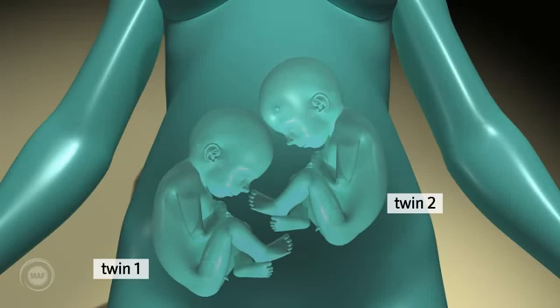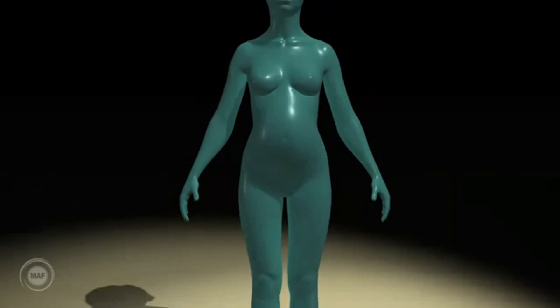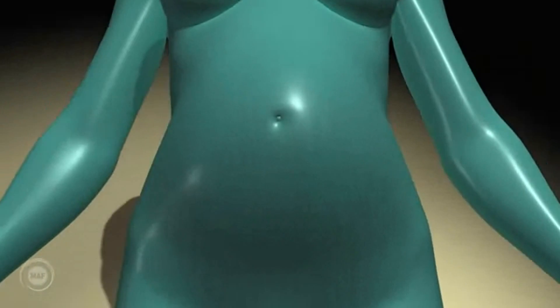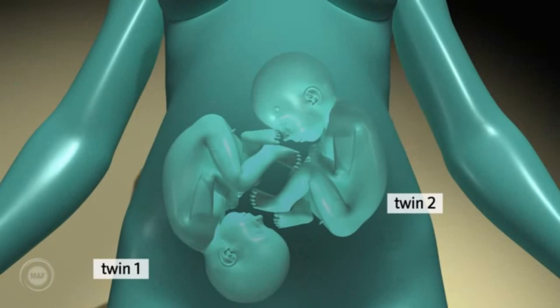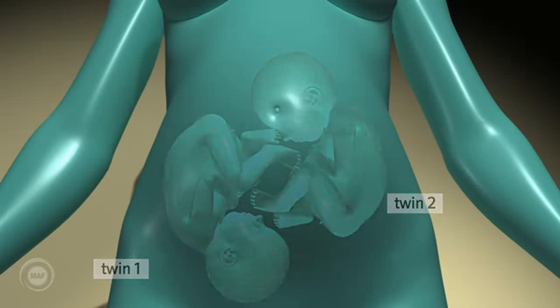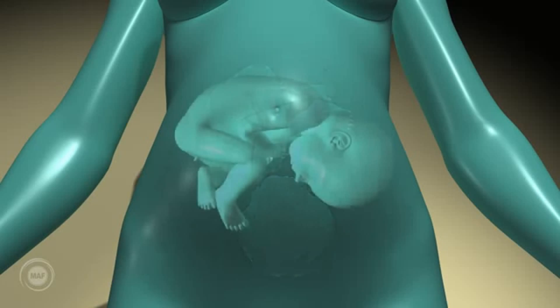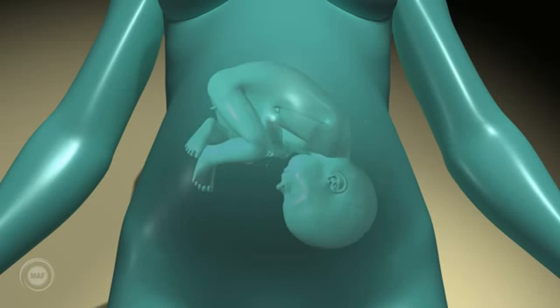Clearly, in some instances, twin 1 may be cephalic and twin 2 may be breech. The lie of the twin refers to whether the twin is in the longitudinal, transverse or oblique position.